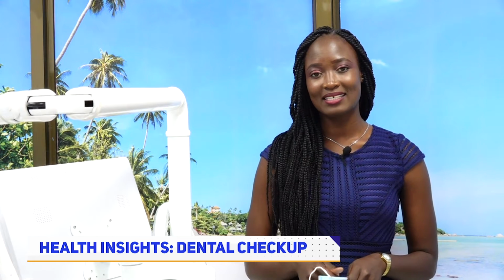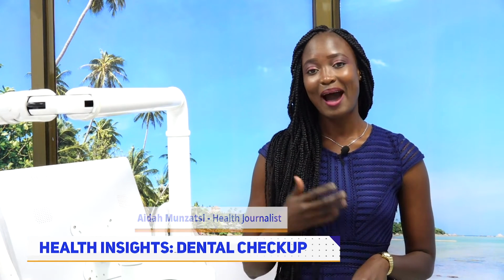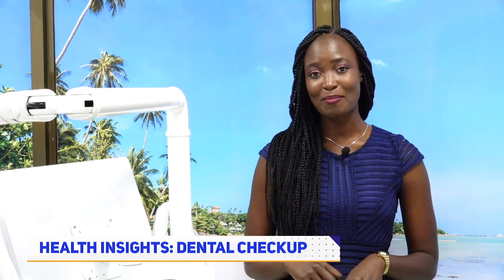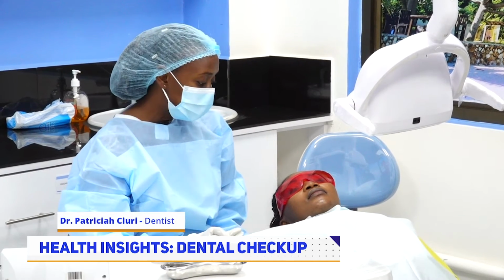We are looking at oral health. So many people fear going to the dentist or just assume going for those dental checkups. So in this part, you'll have a look at what exactly happens during a dental checkup. Here we have our patient who has come in and we want to examine.